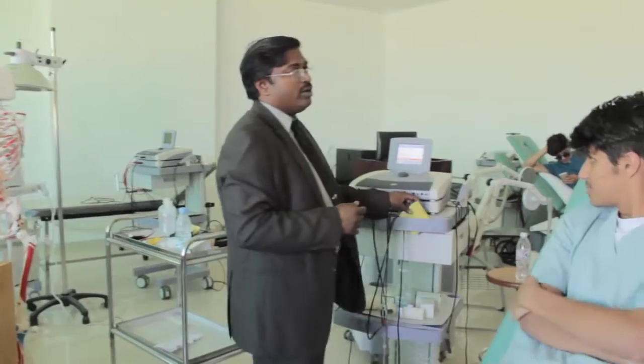Okay? They are the medium frequency currents. Russian currents usually have a frequency of 2500 Hertz. They are given in 50 bursts per second with 10 milliseconds duration between each pulse burst. So the effect of Russian currents is a low frequency effect, but the current is a medium frequency current because it is given in a 50 Hertz per second burst frequency. So that's why Russian currents are very good to stimulate the muscles.